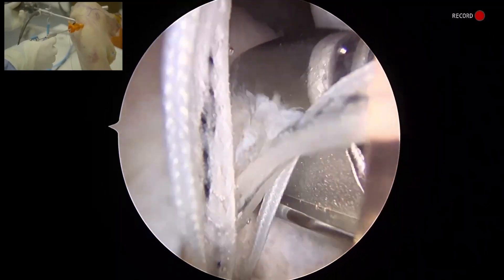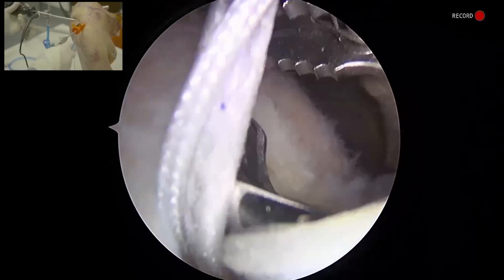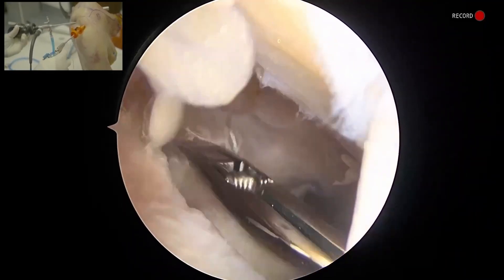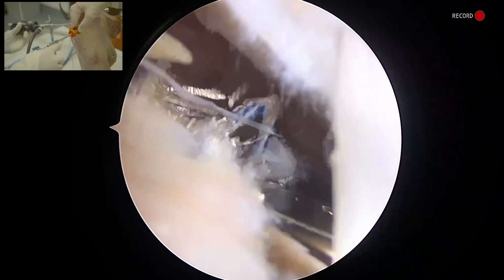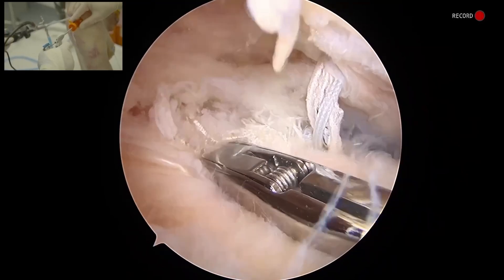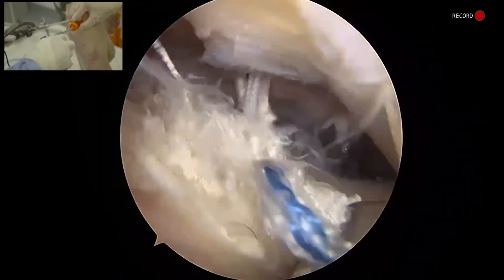Now I'm going to pass my sutures anteriorly first. Full thickness bite of the rotator cuff here. I'm looking at the anterior cable, and once I'm happy with my position, I'm going to fire this. You can see that self-capturing nature there.